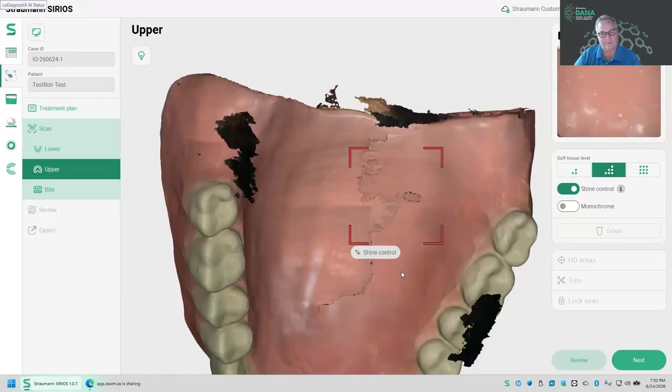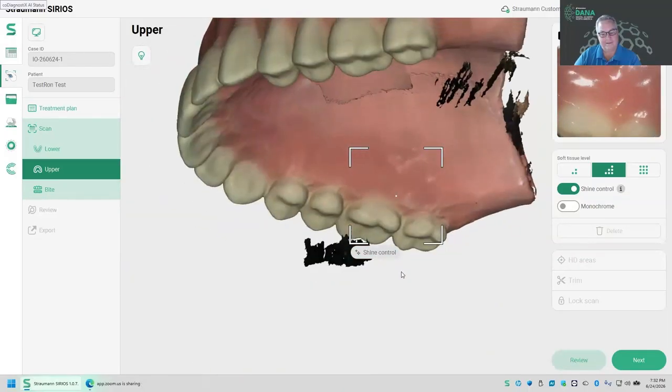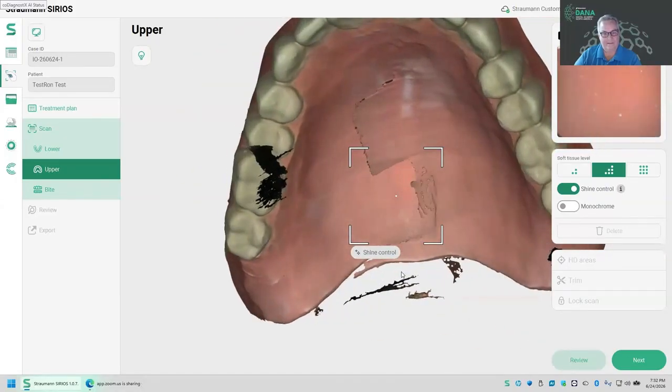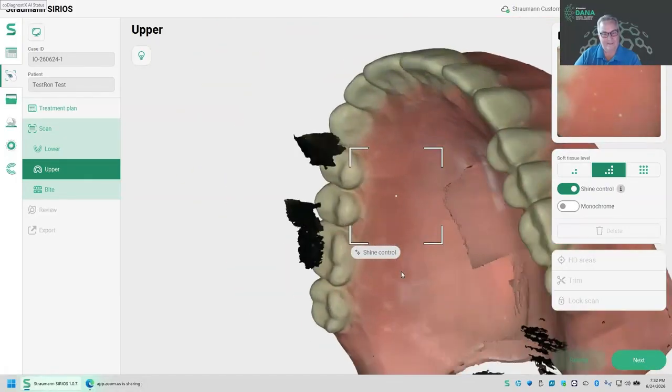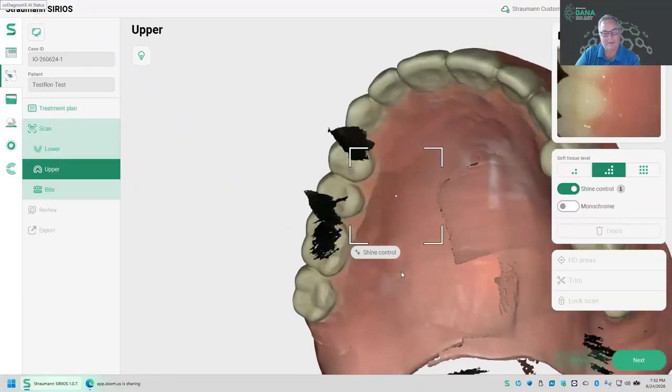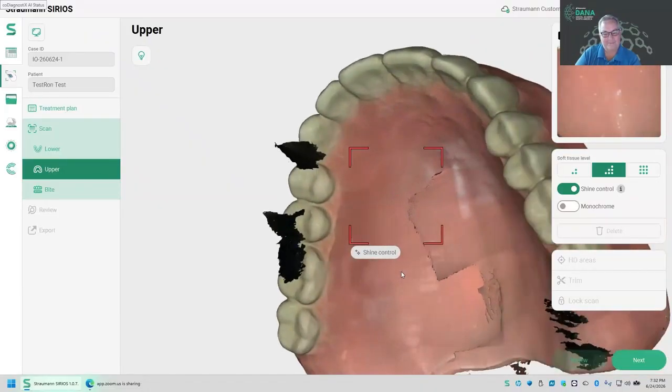That contour should catch it. A thought just occurred to me. The direction I'm holding my denture is reflecting light from outside.